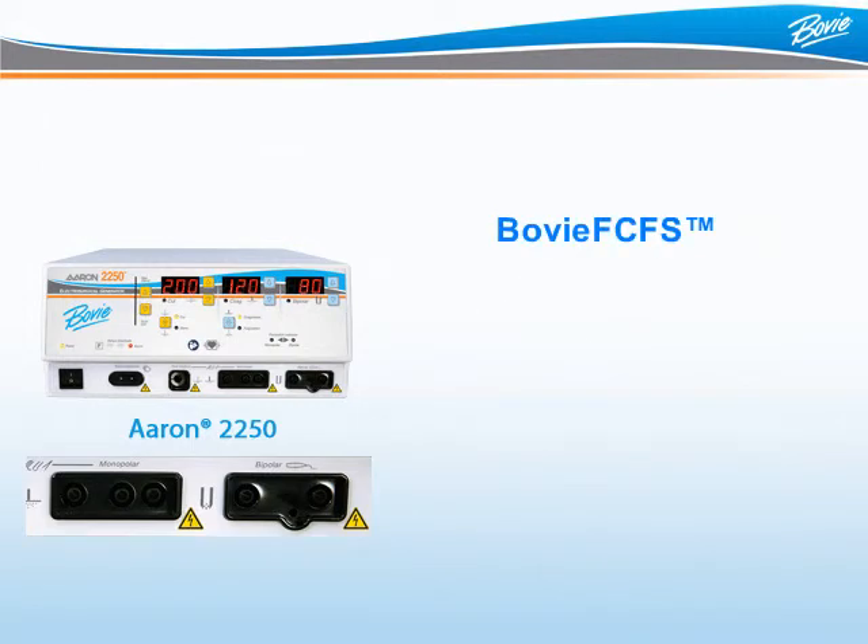Sometimes a doctor will have multiple accessories attached to a unit. The BOVI-FCFS, or First Come First Serve feature, eliminates the risk of unintended activation by allowing only one accessory to be activated at any given time. Secondary commands will not override the first.